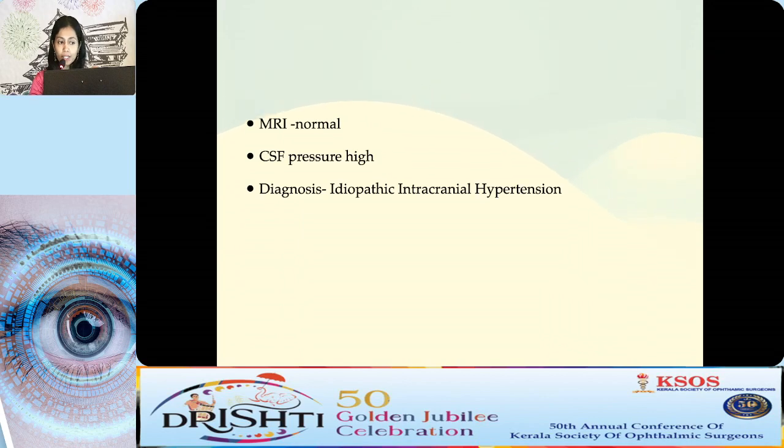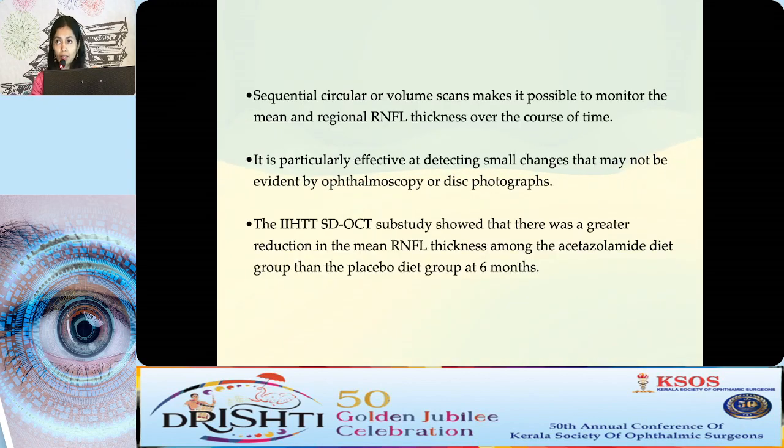To investigate, the patient was investigated with MRI and the CSF pressure was found to be high. The diagnosis is idiopathic intracranial hypertension. So here the use of OCT RNFL is not for the diagnosis, but when you are treating the patient, the sequential scans make it possible to monitor the patient, to know the response and when to stop the treatment.